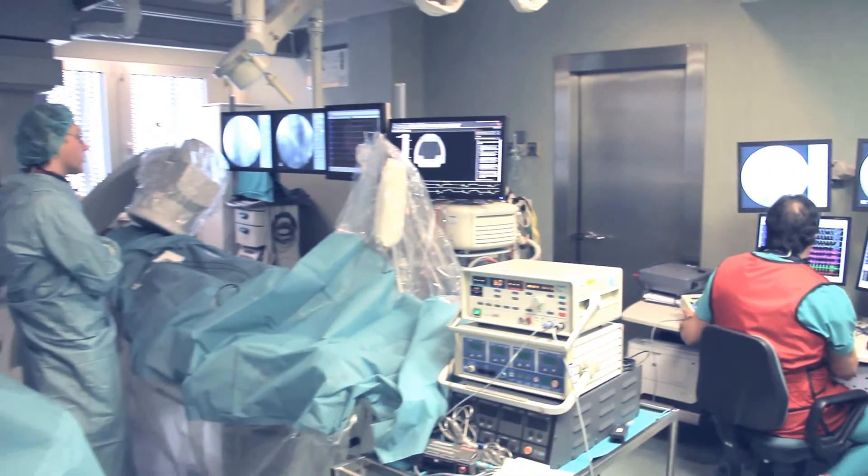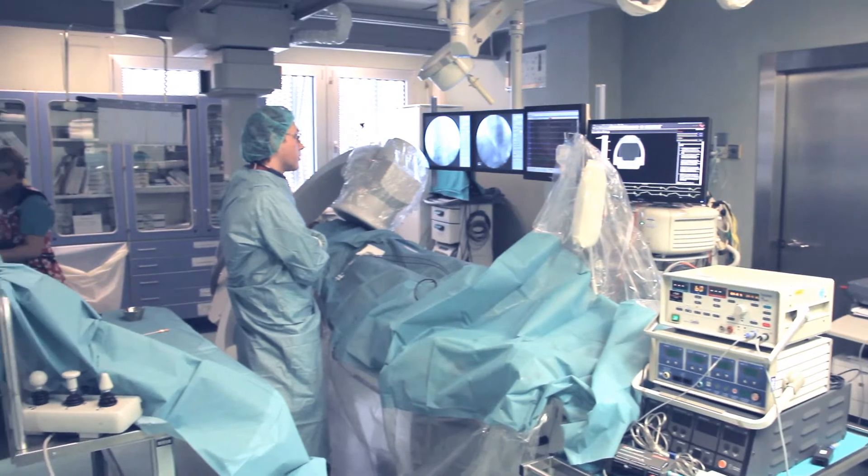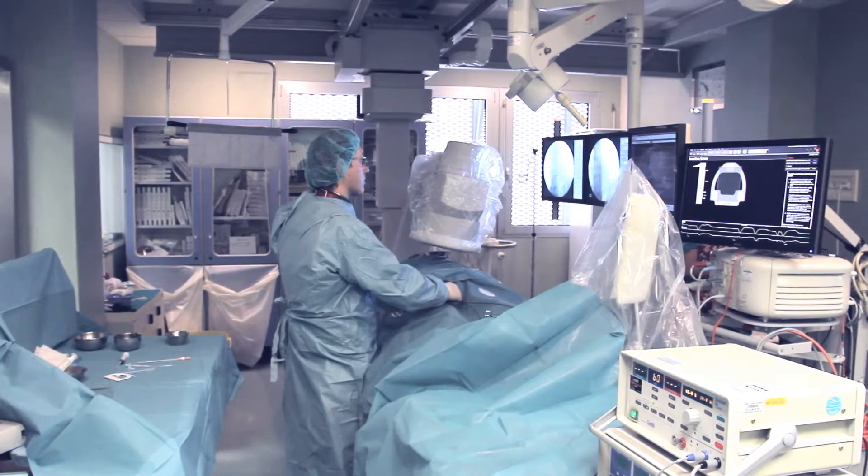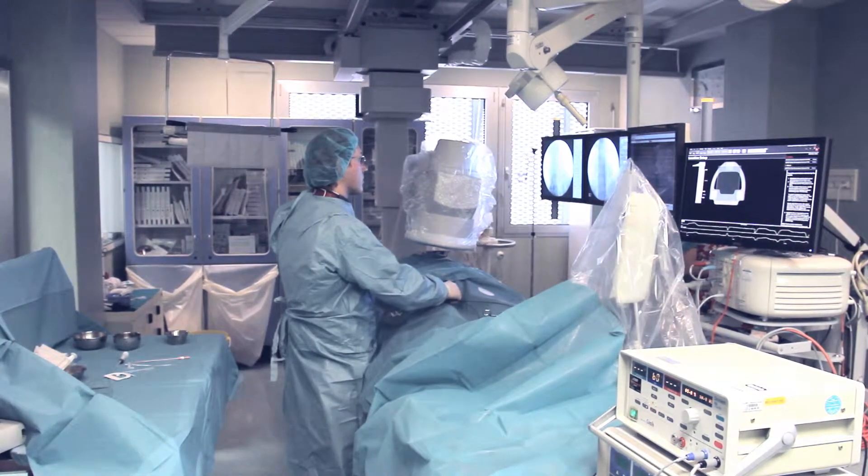The angiographic device ARIS MR Cardio is a system for interventional radiology and cardiology. ARIS MR Cardio with a ceiling mount provides convenient access to the patient and full coverage of his body.